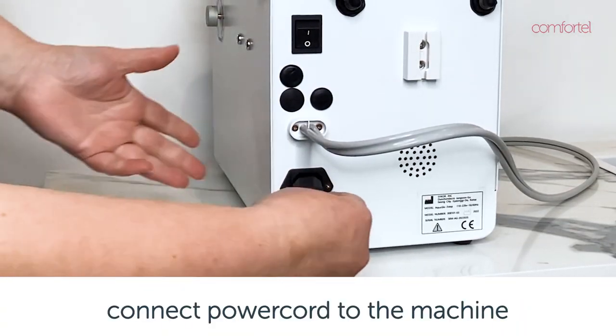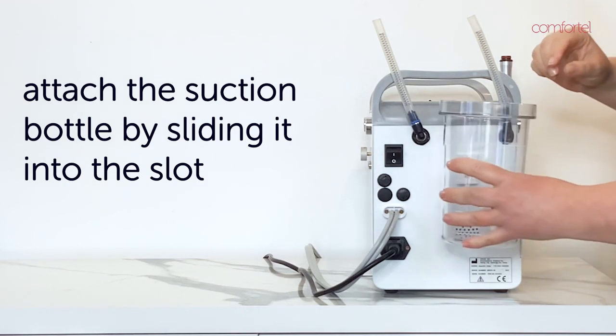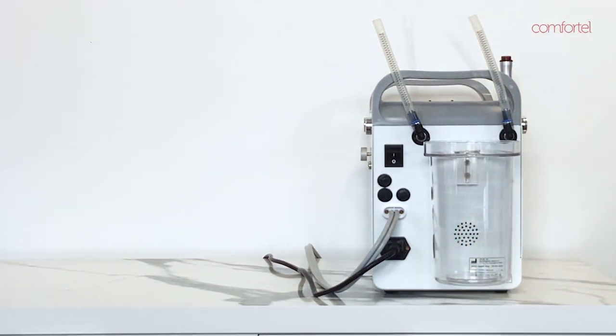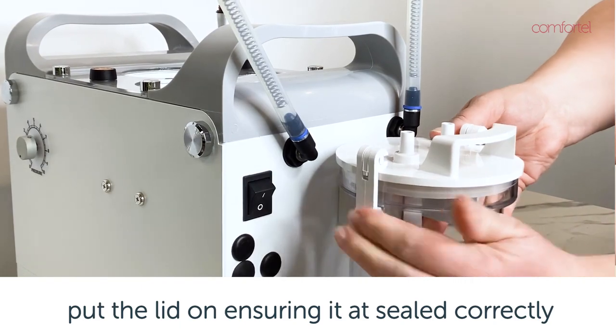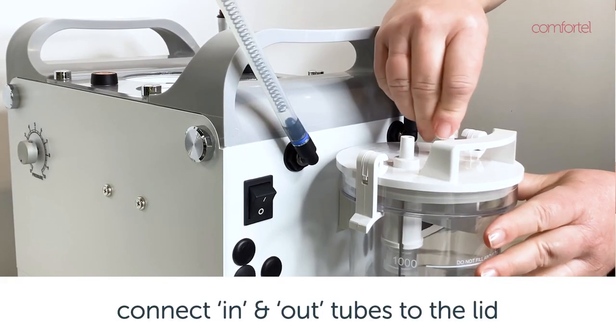Insert the power cord into the system and then into the wall plug. Attach the suction bottle to the back of the machine by sliding it into the slot. Put the lid on, clip it into place, and ensure that it is sealed correctly.